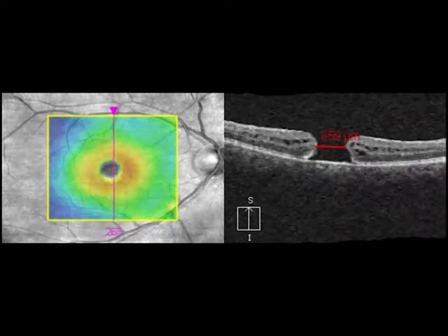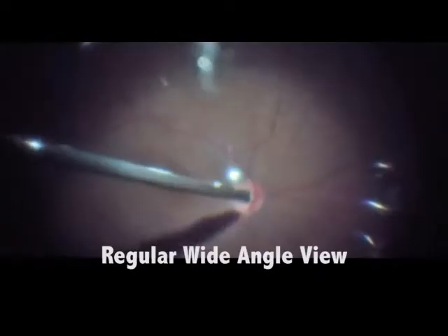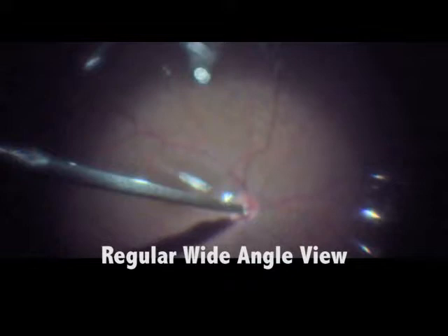The hyaloid is already detached. That's a regular vitrectomy, not inverted, with an air-fluid exchange.